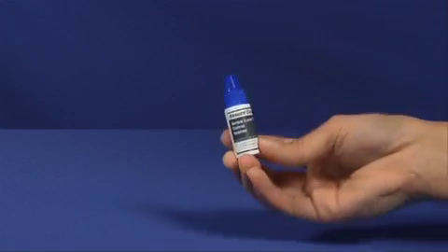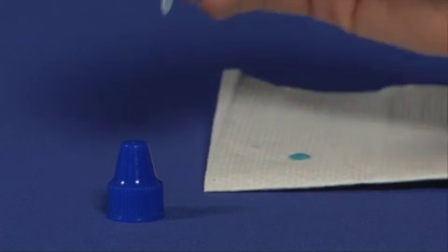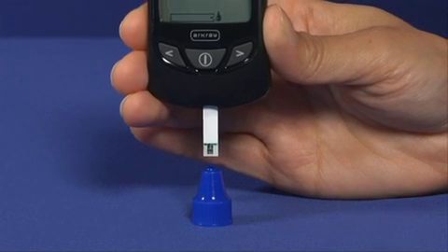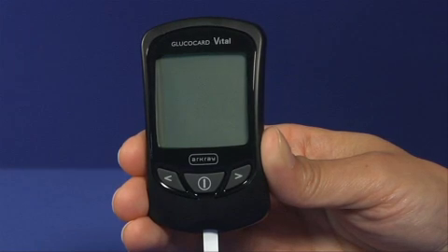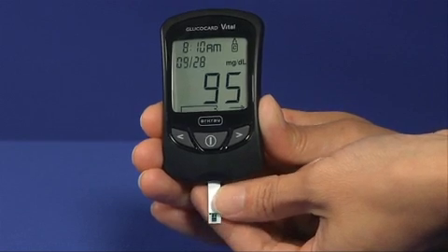Begin by gently inverting the control solution bottle several times to mix. Remove the cap and place it on a flat surface. Squeeze the bottle and discard the first drop of solution. Apply the second drop to the top of the cap. Bring the meter and test strip to the drop of control solution — using capillary action, the test strip will draw up the solution. Results will be displayed in 7 seconds. Compare the result with the range printed on the test strip bottle, checking the correct range for the level of control solution used. If results are outside of the range, check the troubleshooting guide in the user manual. Remove the test strip and dispose.